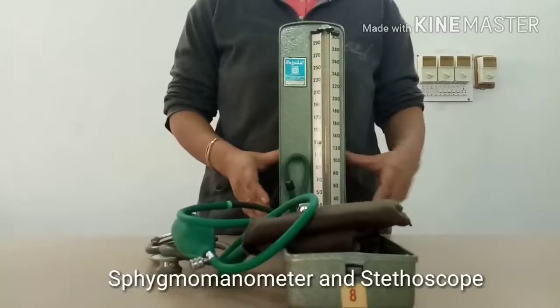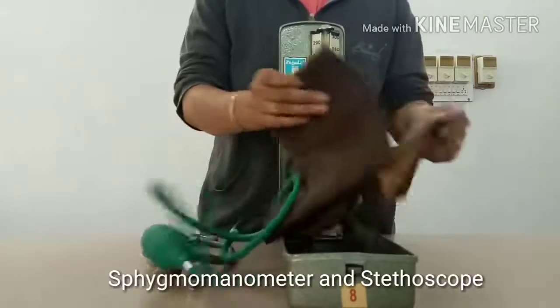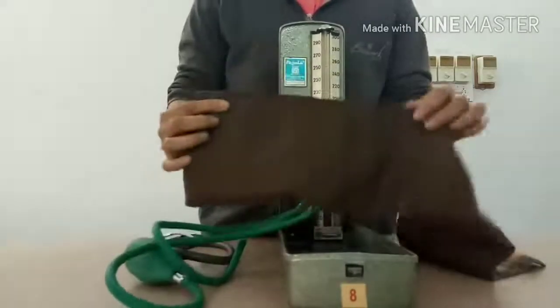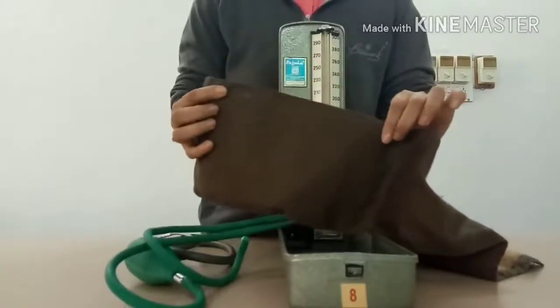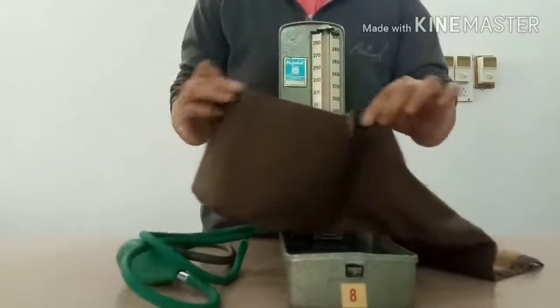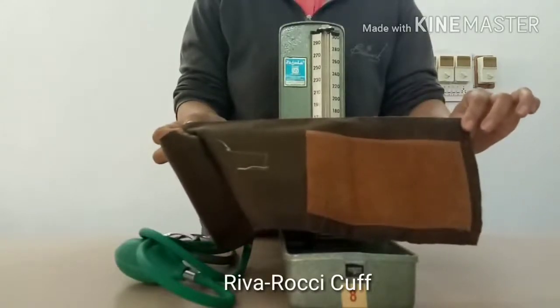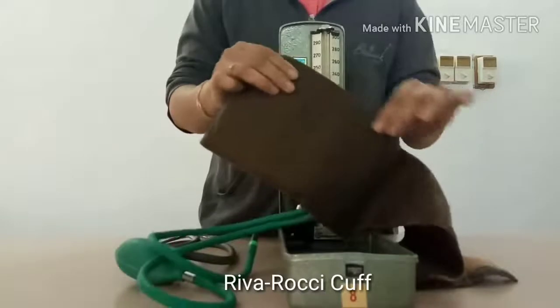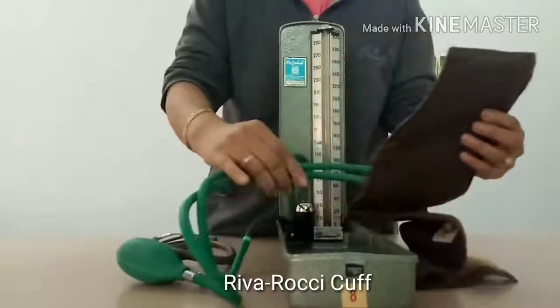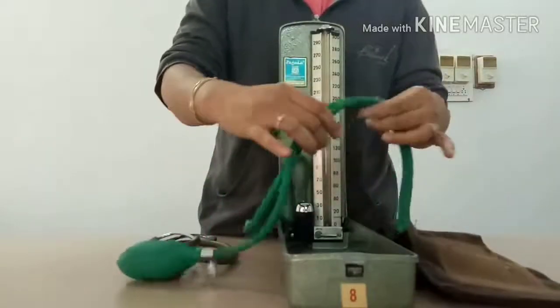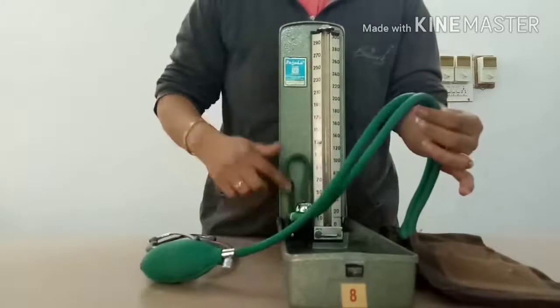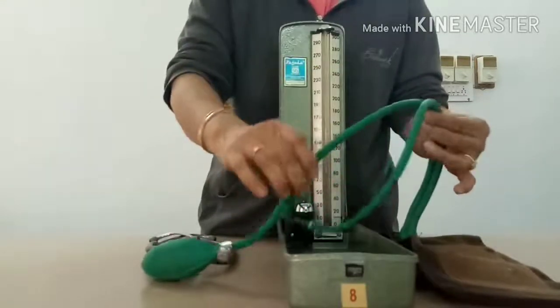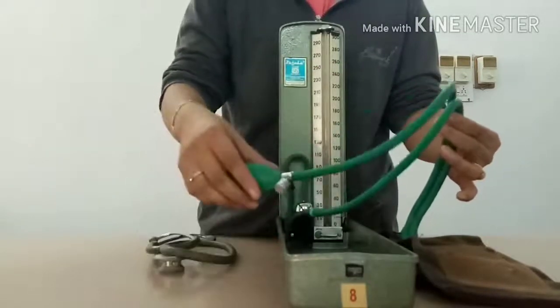The sphygmomanometer consists of an inflatable flat rubber bag covered by a non-distensible cloth envelope called the Riva-Rocci cuff. The cavity of the bag is connected by a long rubber tube to a manometer and by a short rubber tube to a rubber pump.